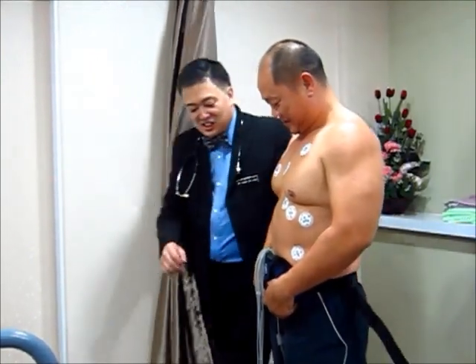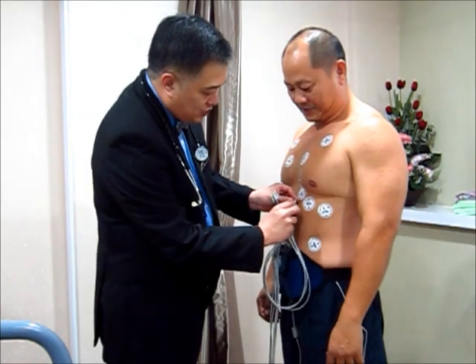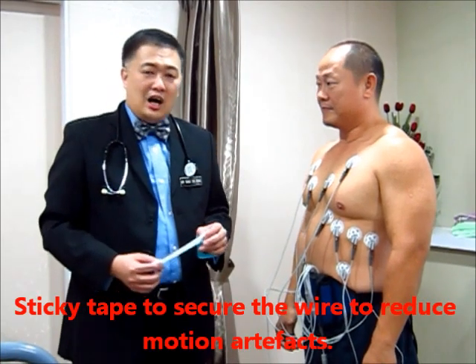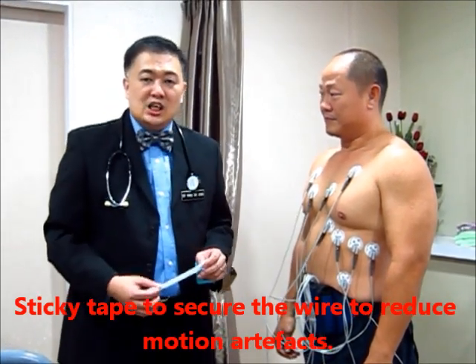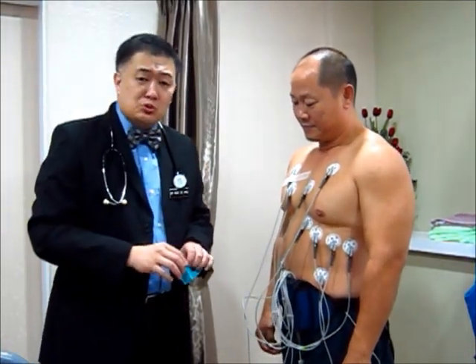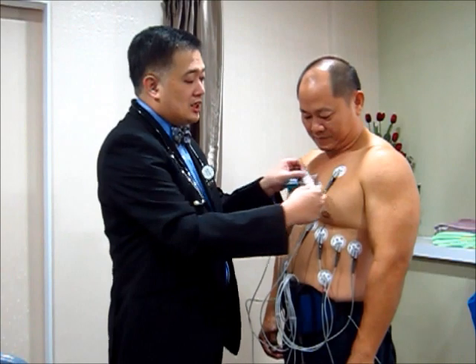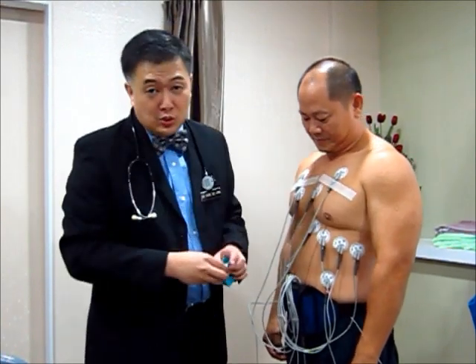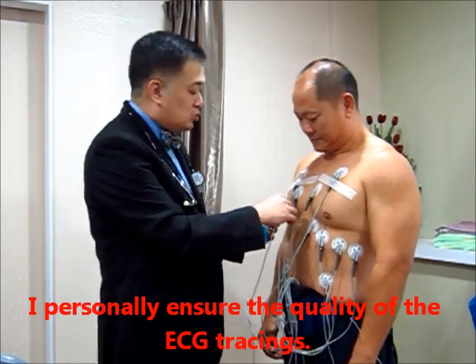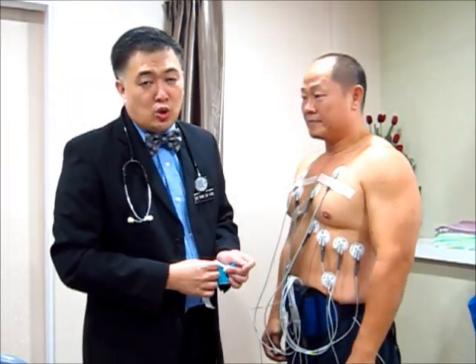Next I will attach all these electrodes to different parts of the ECG. After attaching all the ECG leads, I like to put sticky tape on the wires because during the treadmill, as the patient runs faster and faster, there will be movement of the skin and vibration of the wires. If the wires are not well secured, the ECG will have a lot of interference and artifact, making reading and analysis impossible and often leading to the wrong conclusion.